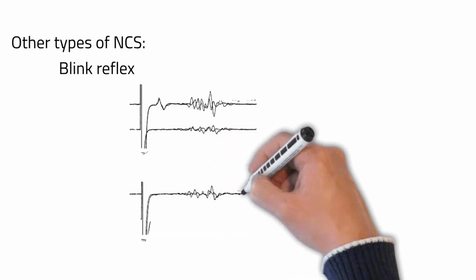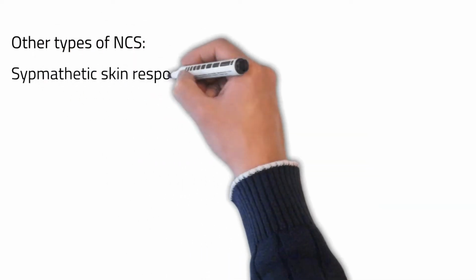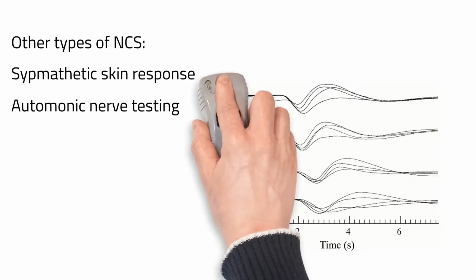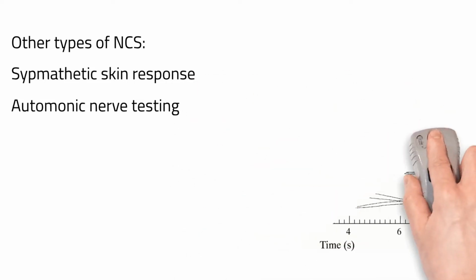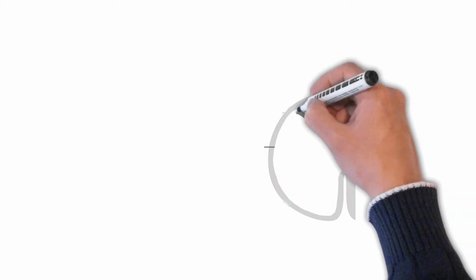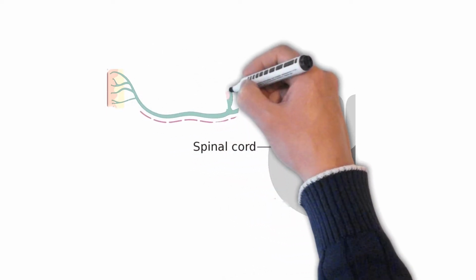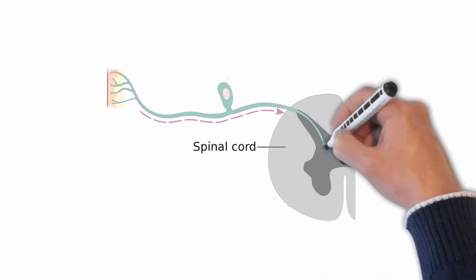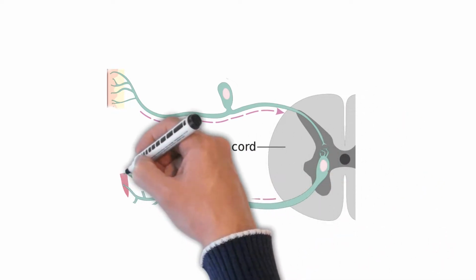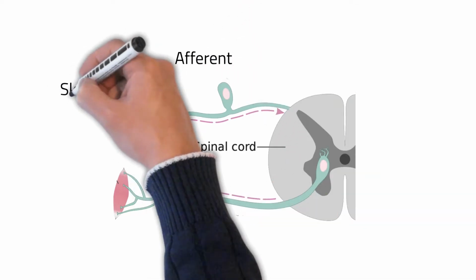So these are myelinated fibers, all of these. We have the ability with this particular system to record even from the unmyelinated C fibers. These are afferent fibers. So afferent and efferent, let's clarify the definition. Afferent fibers are sensory fibers, all right? A-F-F-E-R-E-N-T, afferent. And these motor fibers are referred to as efferent.